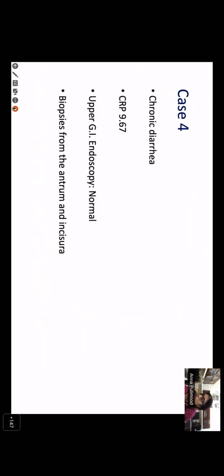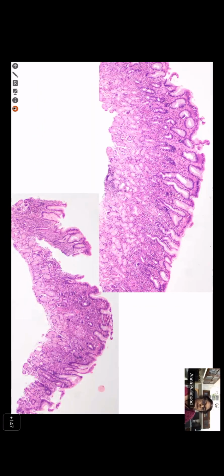Okay, shall we go to Ishan? Yes, ma'am. Okay, what are you seeing, Ishan? This is an H&E section from the antral part of the stomach, ma'am.